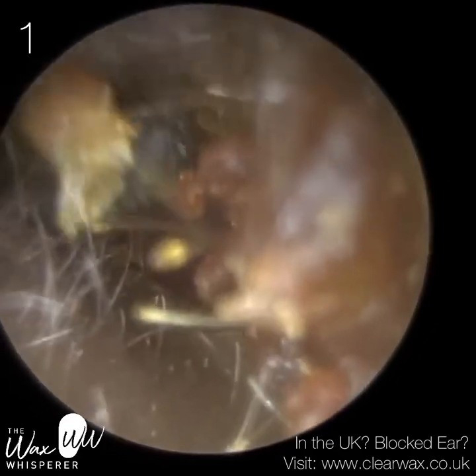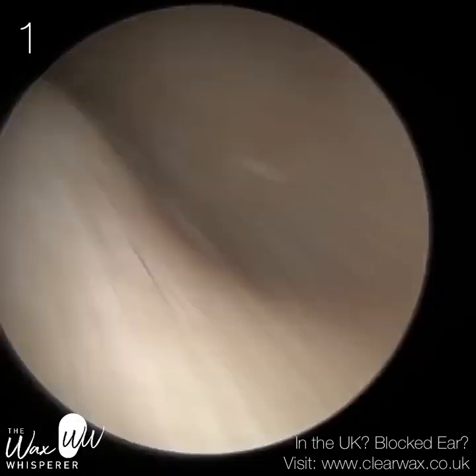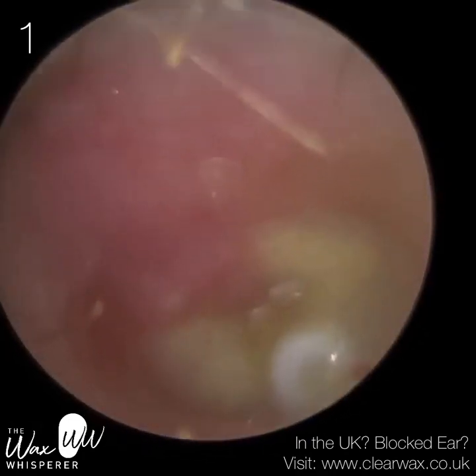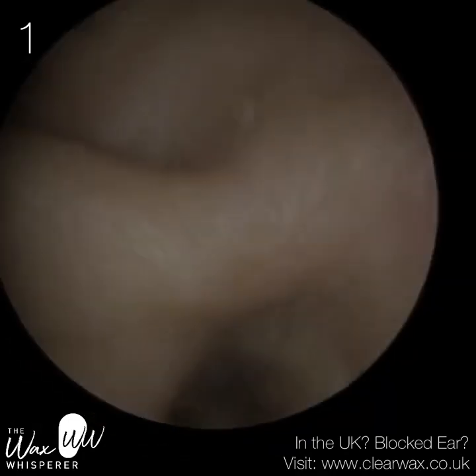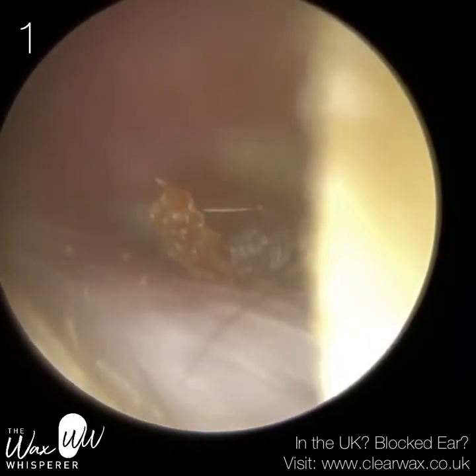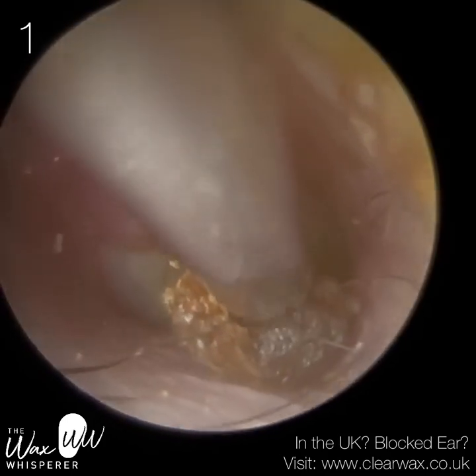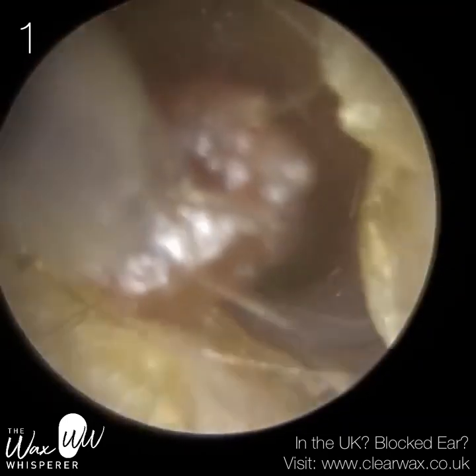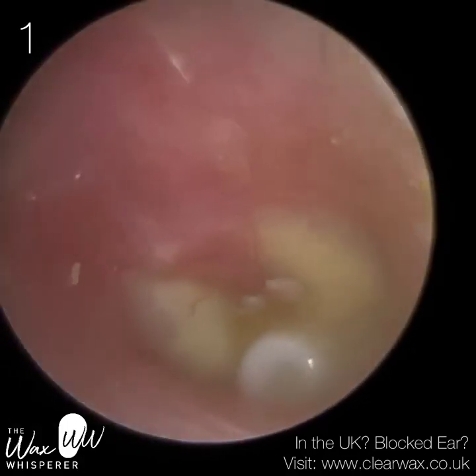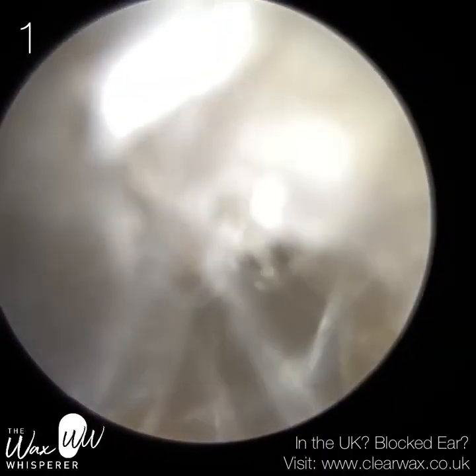But in a minute you're going to see that my auntie actually has a grommet as well. I'm going to explain what a grommet is and how this infection occurred in more detail during the course of the video. So this is her first appointment. She visited me a couple of weeks ago, and now you can see we removed all the debris, all the wax, all the keratin that's occluding the ear anyway. And that in the distance is her eardrum. This is her left ear.